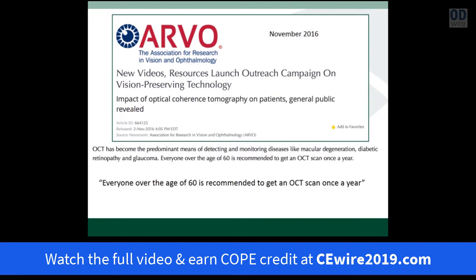OCT has really changed how we look at retina and how we manage glaucoma. Here's a position statement that ARVO made in November 2016, essentially stating that everyone over the age of 60 is recommended to get an OCT scan at least once a year. The recognition that OCT's sensitivity in picking up occult maculopathy, AMD, diabetics, vitreomacular tractions, and even identifying glaucoma suspects can be very helpful. It's a powerful statement, and why so many on the optometric side have purchased and utilize OCT daily.